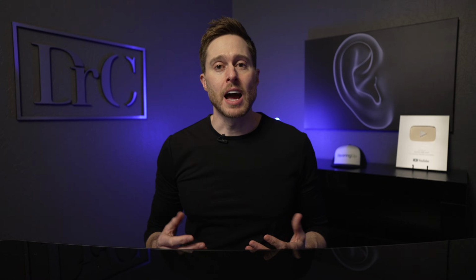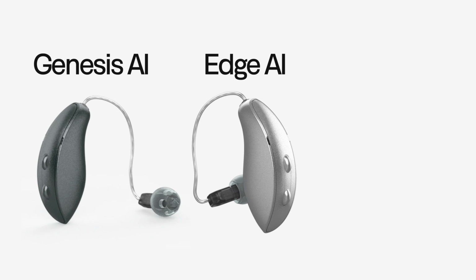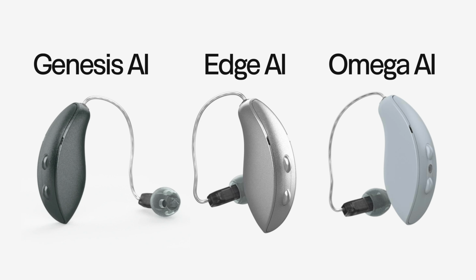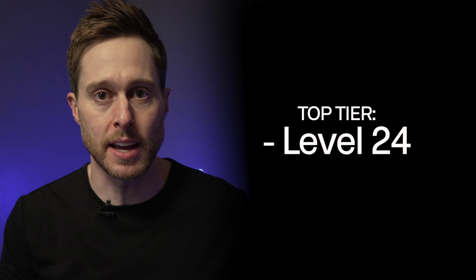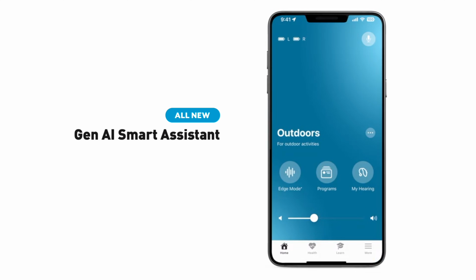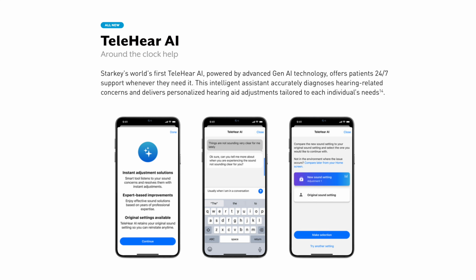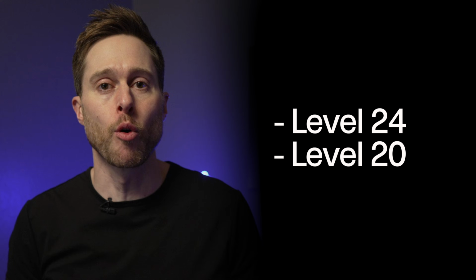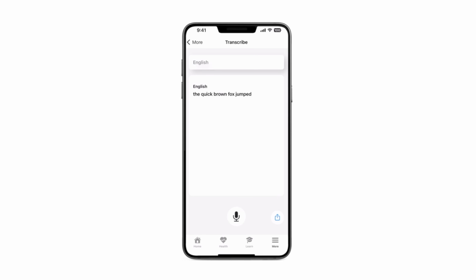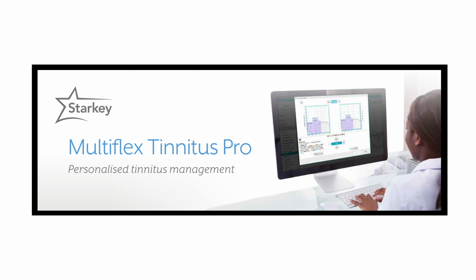Okay, so as of right now, the MyStarkey app is compatible with the Genesis AI, Edge AI, and Omega AI line of devices from Starkey. There are a few features inside of the app that are only available inside of the top tier 24 level of tech. This includes the Gen AI Smart Assistant as well as Telehear AI. And in the top 2 tiers of technology level, which means level 20 and level 24, you also get access to the transcribe feature as well as the multiflex tinnitus pro feature.